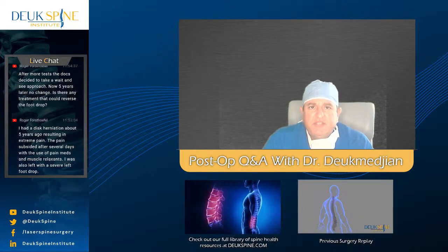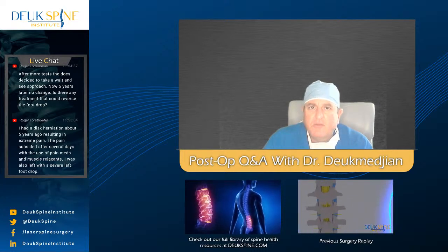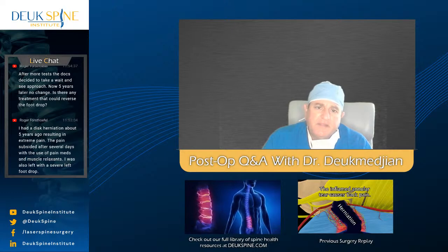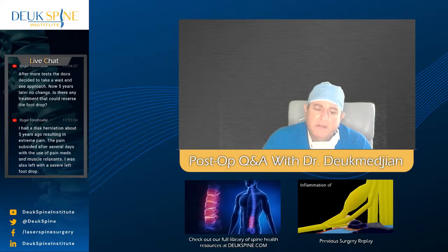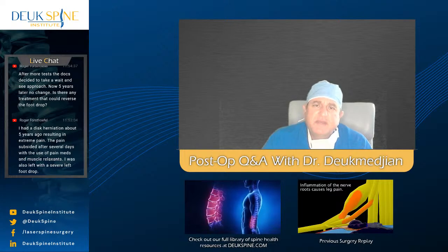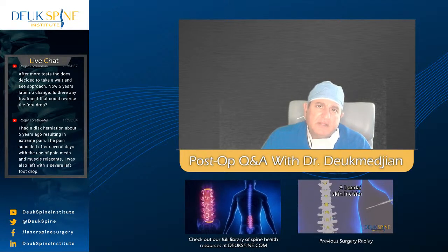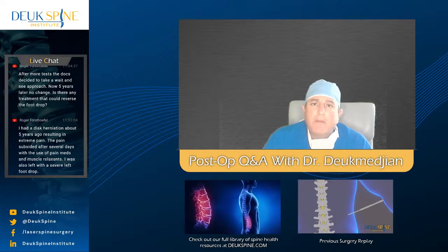So this patient had a foraminal herniation, back and leg pain. We confirmed her back pain was from L5-S1 with the evocative discogram, which was done in the beginning. And I think her back pain is going to be gone. Her leg pain should be gone. I think she'll be very happy. So she'll be in a back brace for 6 weeks. She'll be restricted not to bend at the waist for 6 weeks and not to carry anything over 25 pounds. But she'll be going home in about 30 minutes from now.